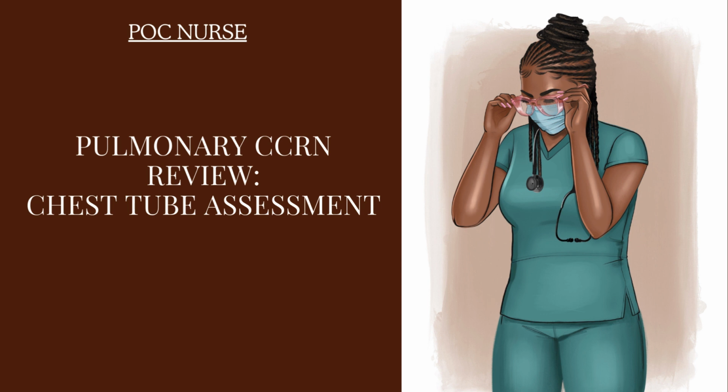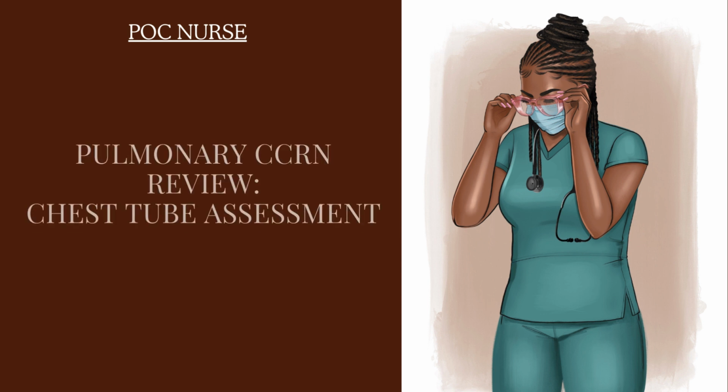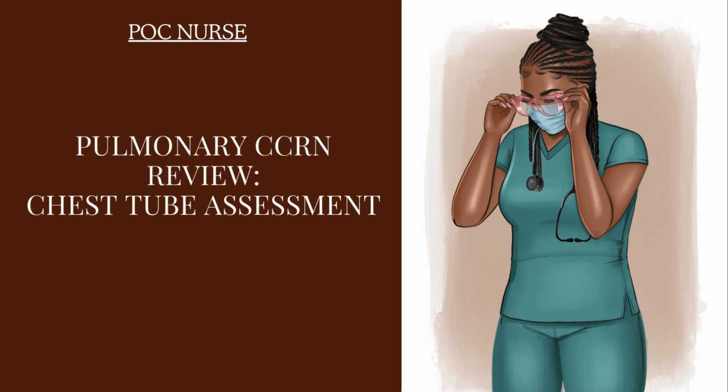So you need to know for your exam that, oh, this patient just got a fresh chest tube placed. You need to monitor the patient more frequently. Now let's talk about nursing assessment of the chest tube. So when a patient has a chest tube, we want to monitor the patient's respiratory status closely, as well as the patient's vital signs. After placement of the chest tube, the patient's respiratory status should get better.